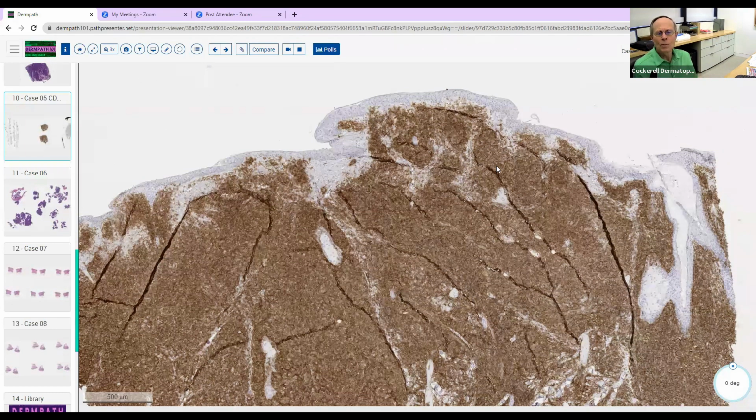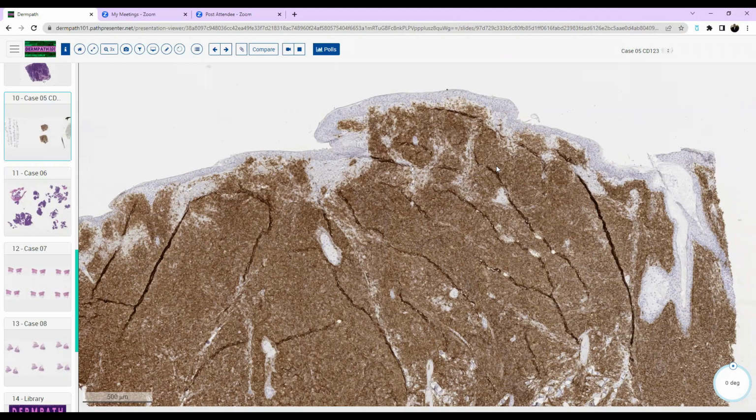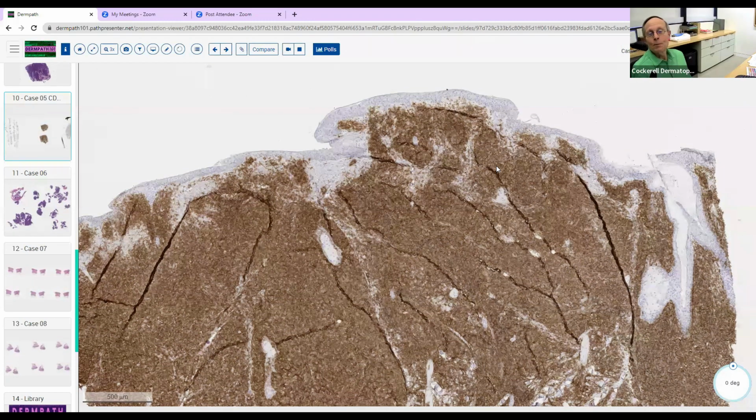You've got a diffuse involvement where you get lots of these cells like this. And there's a couple of other cells that stain positively for this too. You know what those are as well? I think there's some other lymphoma, maybe a B cell lymphoma that you can see this positive for. Well, actually, this is an easy one to remember because it also stains positively for CD4 and CD56. So even a first-year medical student can remember this. It stains positive for 1, 2, 3, 4, 5, 6.